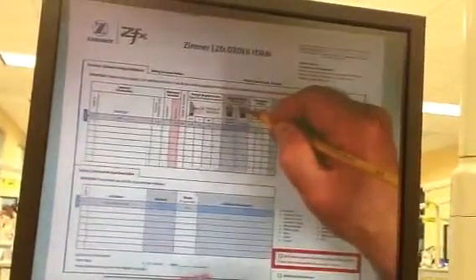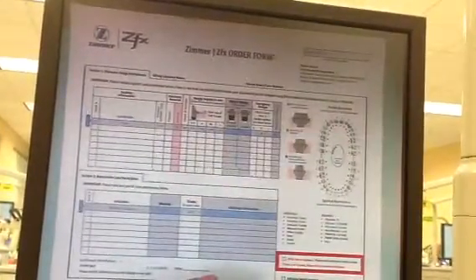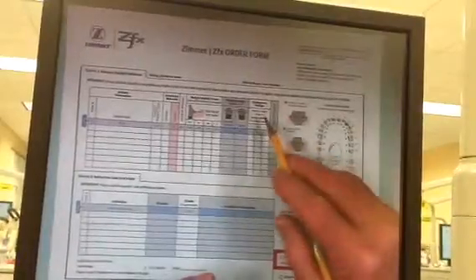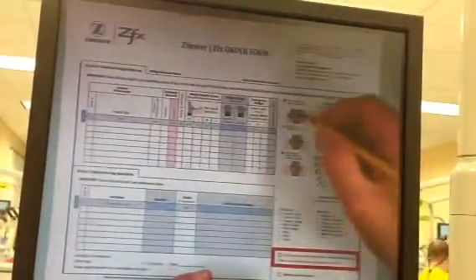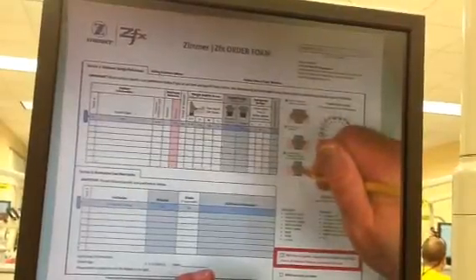Or a default will be a chamfer. Again, in the aesthetic zone, you're going to want a shoulder. In the posterior part of the mouth, you're fine with a chamfer. And then you've got some emergence design where you have A, B, or C.